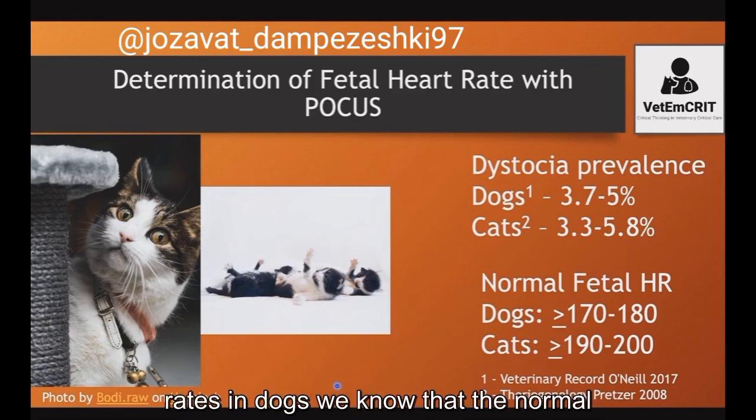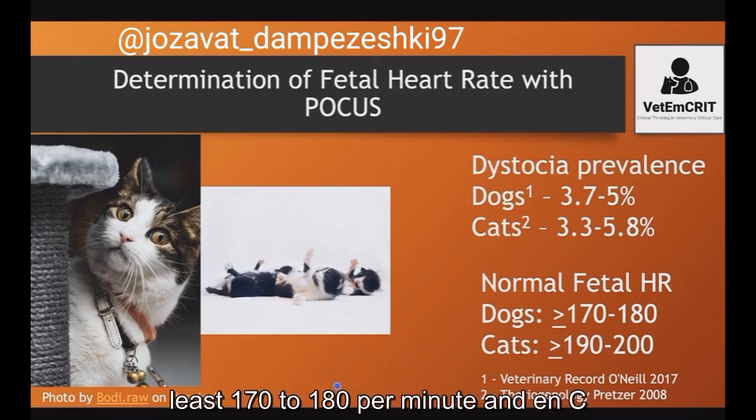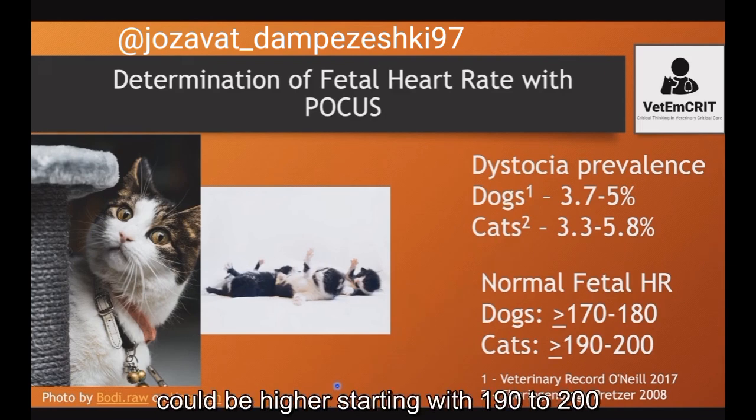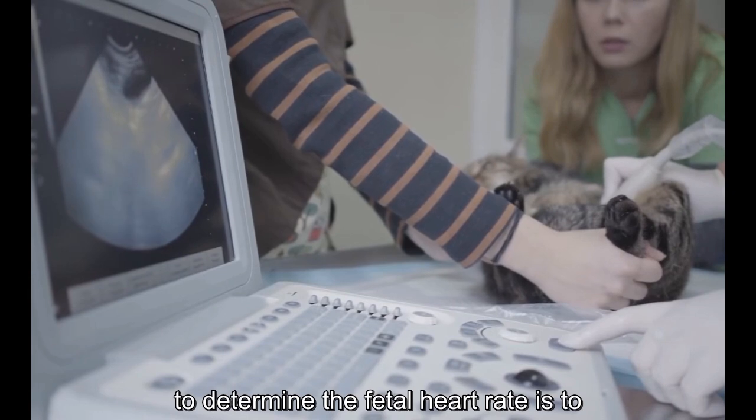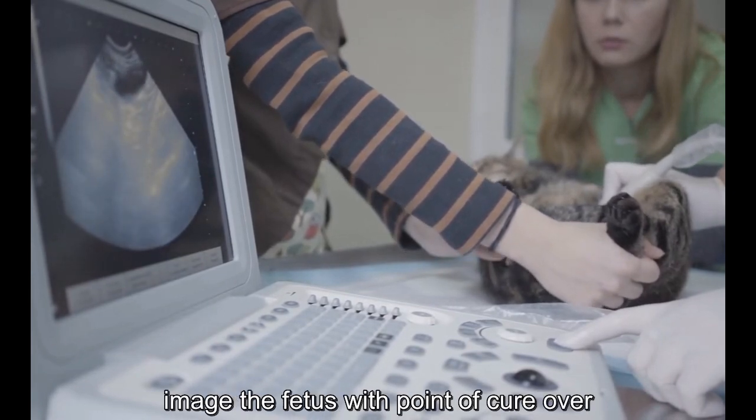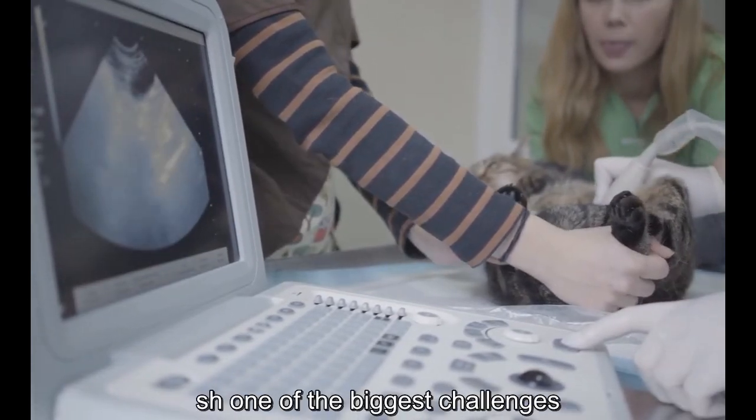In dogs, we know that the normal heart rate of the fetus should be at least 170 to 180 per minute. And in cats, it could be higher, starting with 190 to 200 beats per minute. The most accurate way to determine the fetal heart rate is to image the fetus with point-of-care ultrasound.